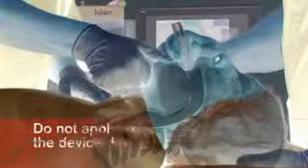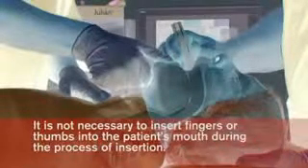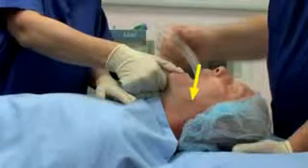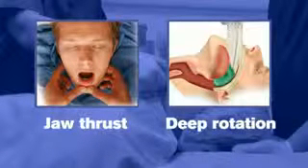Do not apply excessive force on the device during insertion. It is not necessary to insert fingers or thumbs into the patient's mouth during the process of insertion. If there is early resistance during insertion, a jaw thrust or insertion with deep rotation is recommended.